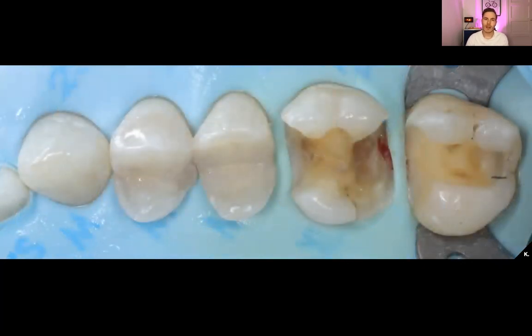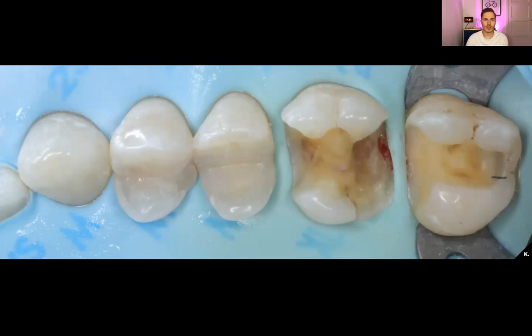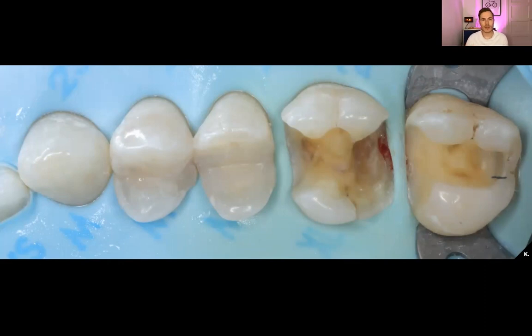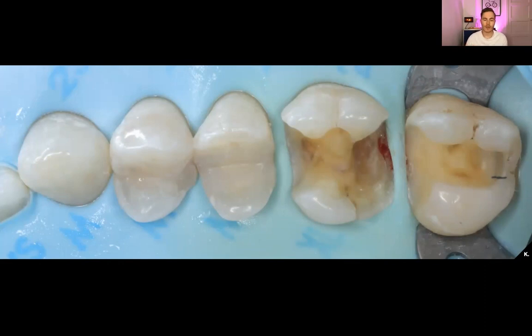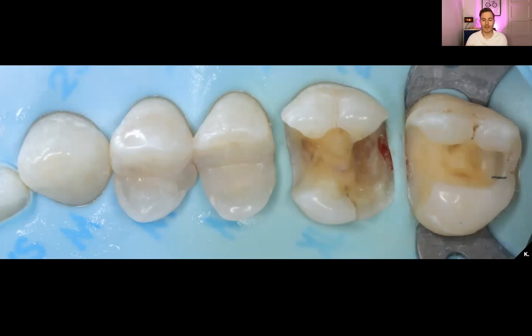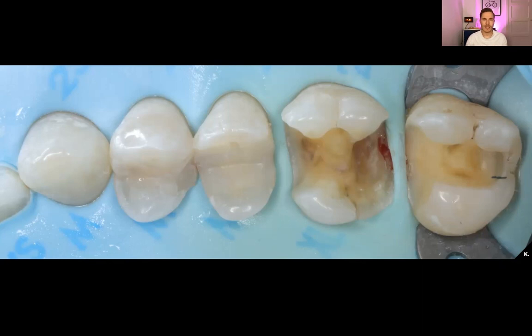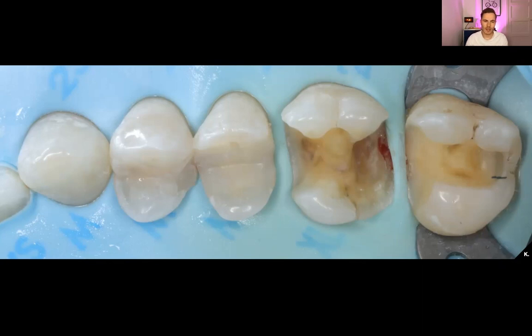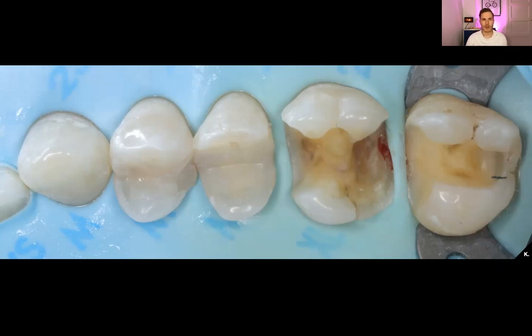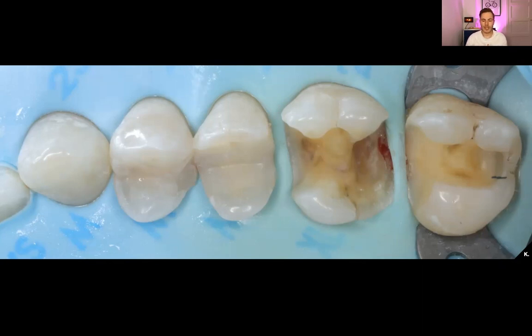Here's what they look like after removing the restoration and removing all the decay. You can see that there is a bit of leakage on the distal side of the first molar and there was some blood contamination.